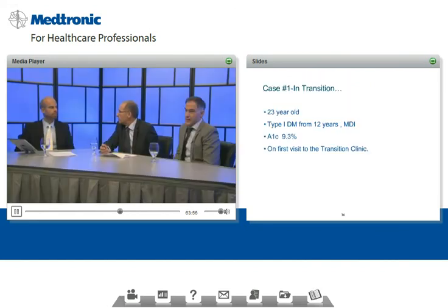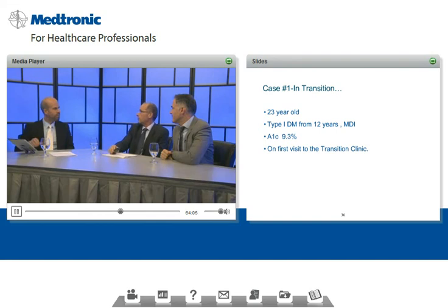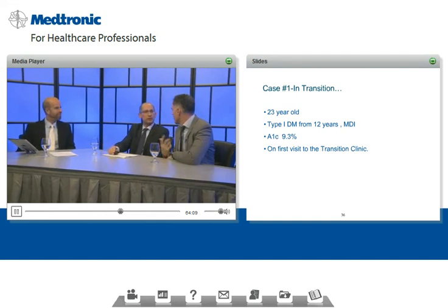I think it's time for us to go into specific cases, right? Sure. Are there any questions from the audience? No audience questions at this time. I think we could carry on. Okay, so let's... Well, maybe I'll ask a question.